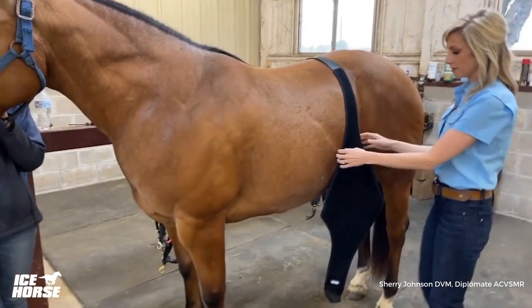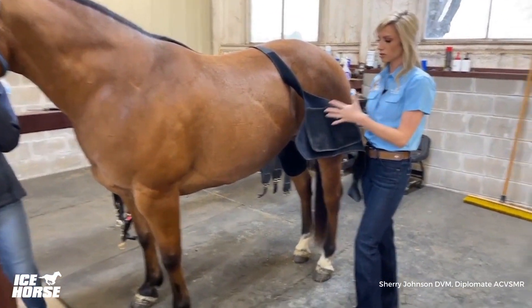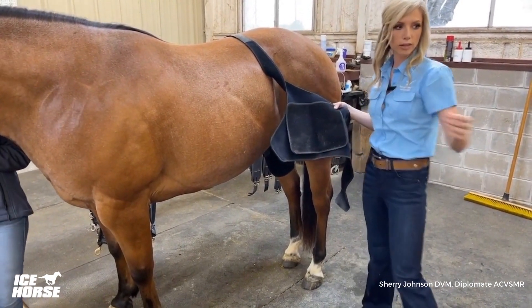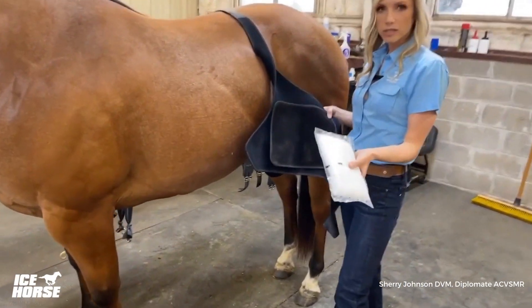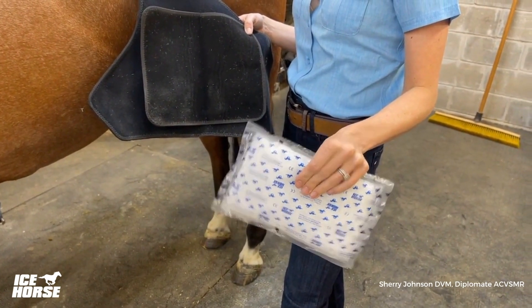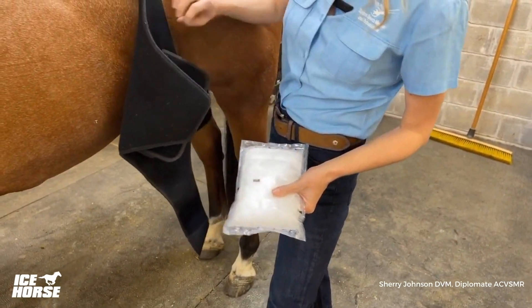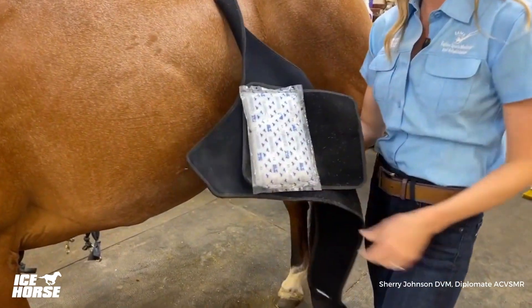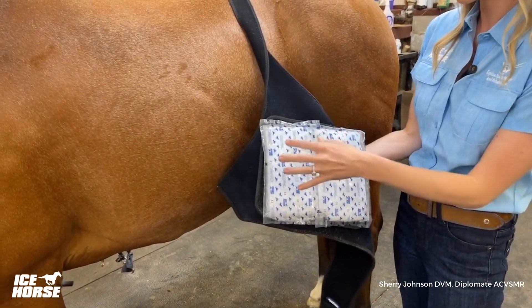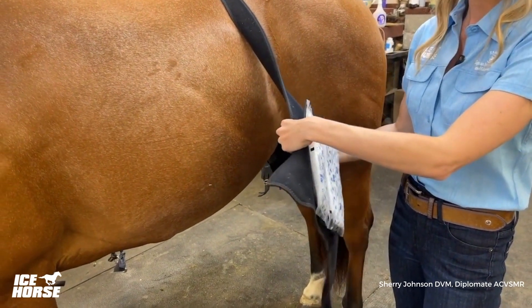Once I've got them nicely fitted, the other thing to note is the landing strips on the inside. This is consistent across all Ice Horse wraps — you've got this nice piece of fabric that serves to anchor the ice or heat pack you're going to use. The ice packs are easily conformable, just pulled from the freezer, and coated in an antimicrobial so everything stays clean. With the landing strip, the velcro straps stick really nicely and won't be falling or awkward when you put it on the horse. These landing strips are placed for both the medial femorotibial joint and the femoropatellar joint — the ones we're most concerned about in typical injuries.